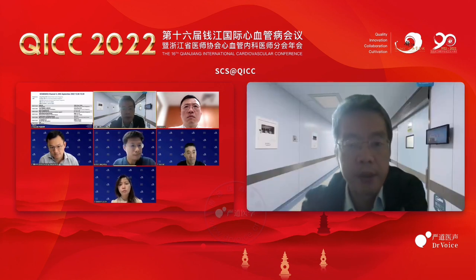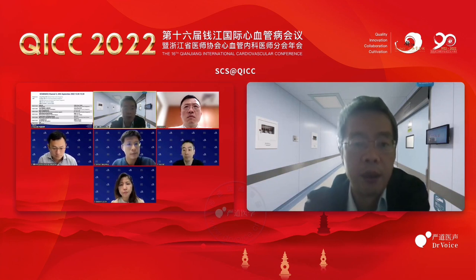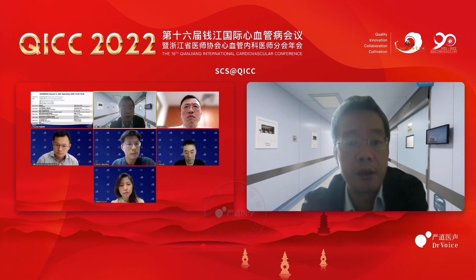For patients with a chronic kidney disorder, chronic kidney dysfunction, do you always use IVUS for guidance? So for patients with some calcification or with some chronic kidney dysfunction, I will rely on the imaging technology to evaluate the heart, evaluate the stent, and then to reduce the long-term complications.